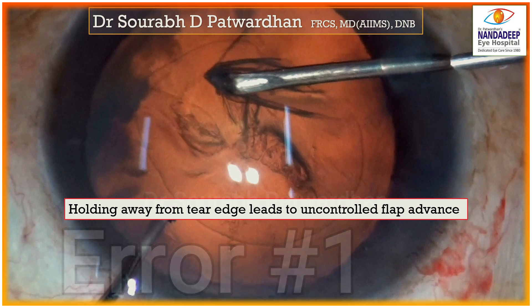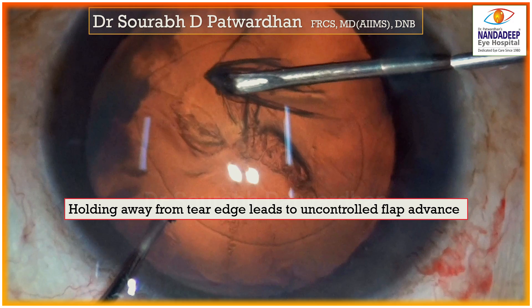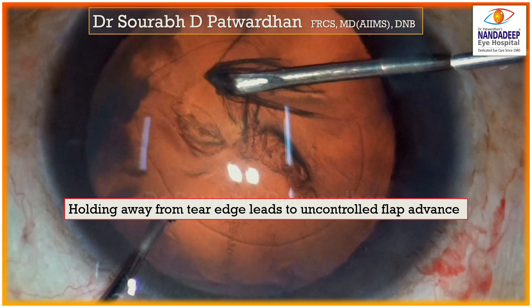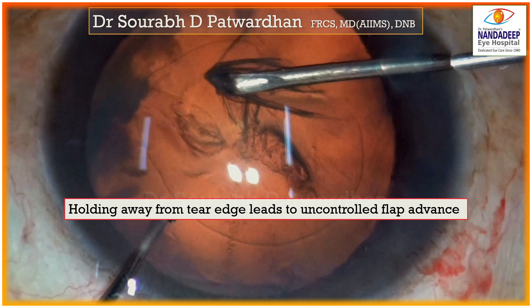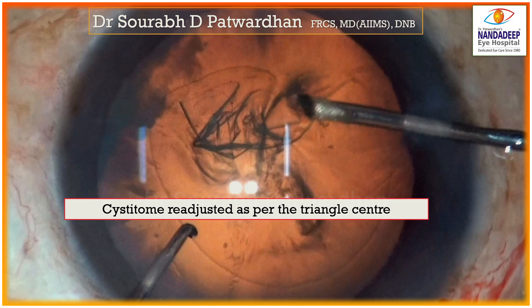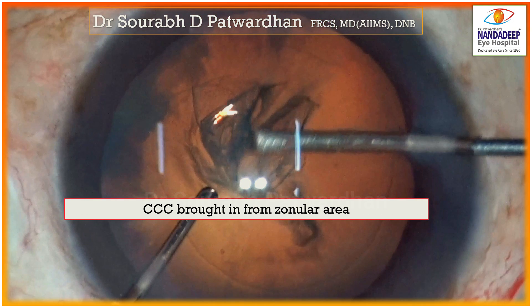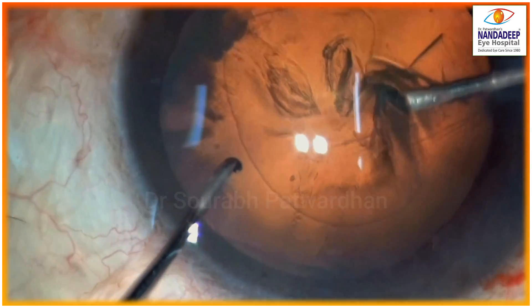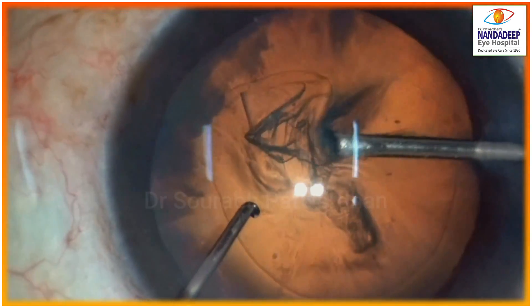Error number one is when you hold this tear away from the center of triangle — it may lead to uncontrolled flap advance, as happened in this particular case. It can again be regripped by holding at the center of triangle and brought back in. You can see it advances, but when I hold it again at the center of triangle, I can bring it in.